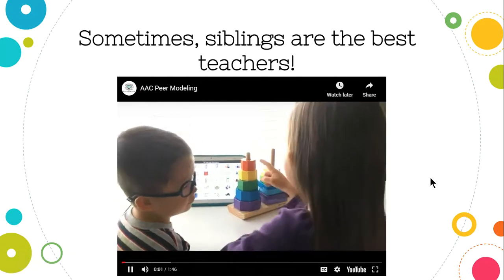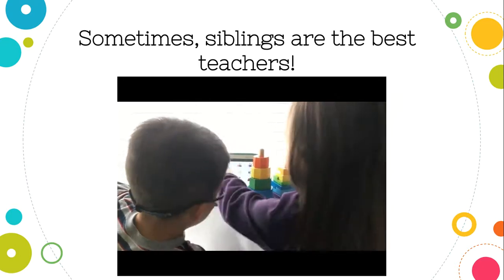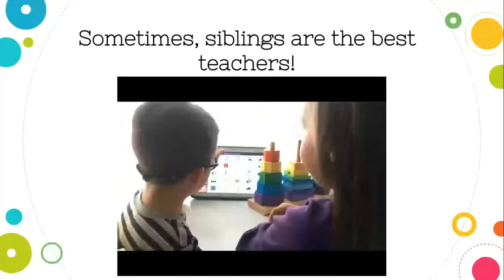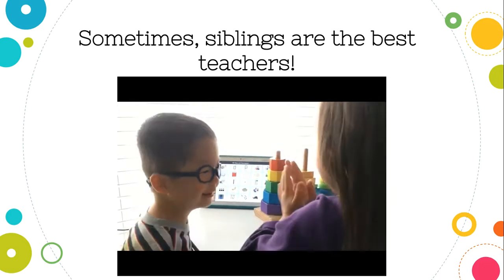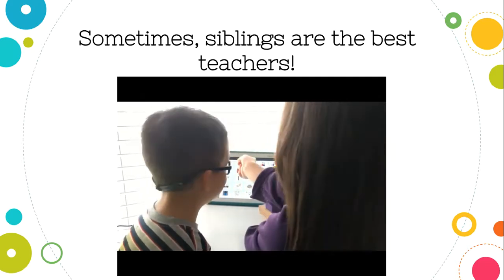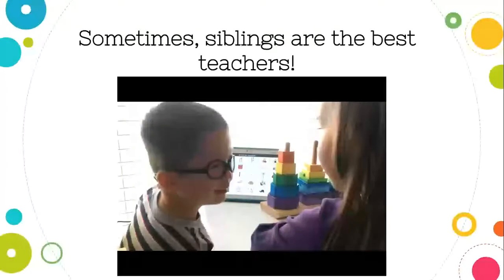Look at all these shapes. You see, orange is on that top. Can you press top? Chop, chop. Good. Now you see purple is on the bottom. Bottom. Can you press bottom? Bottom. Good.